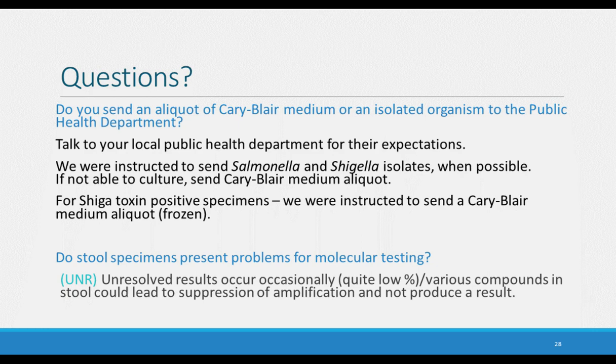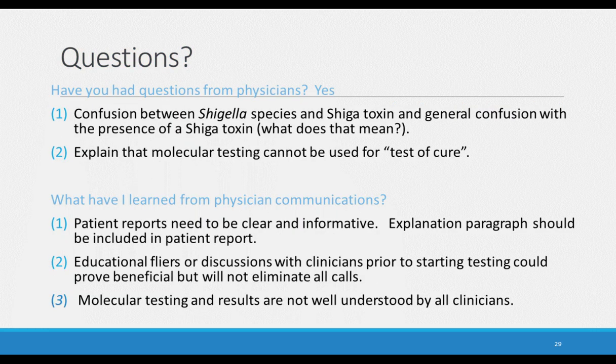The most common interfering substance with most assays are lubricant solutions that are used for specimen collections. But we're kind of blindsided in the laboratory. We have no clue what might really be used for collection or be in these specimens. So we deal with an unresolved issue. But as I say, it's a very low percentage and should not present you a problem.